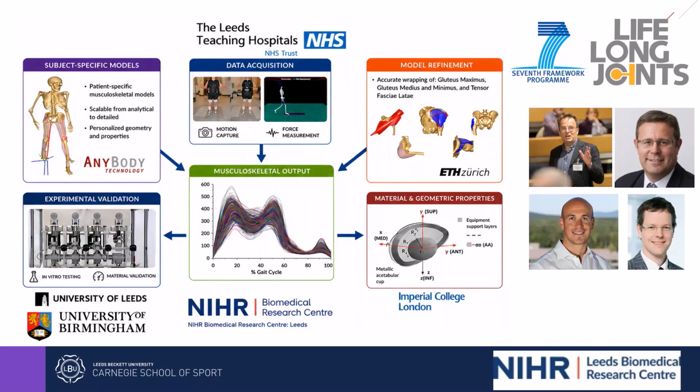collecting in the lab. So then once we create these waveforms, like I said, these were to be used for preclinical testing, both in vitro testing, which was done by a purpose-built simulator that was able to reproduce the waveforms. This simulator was held at the University of Leeds at the time and produced by Simulation Solutions, but has now since moved with Professor Richard Hall and Professor Michael Bryant down to the University of Birmingham.